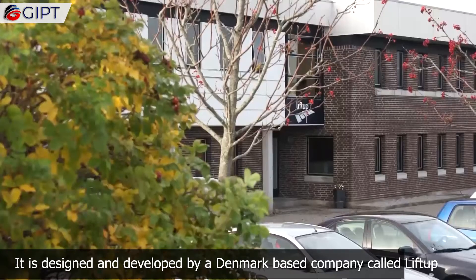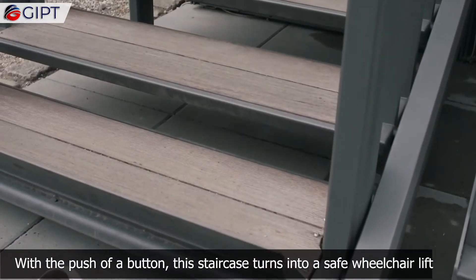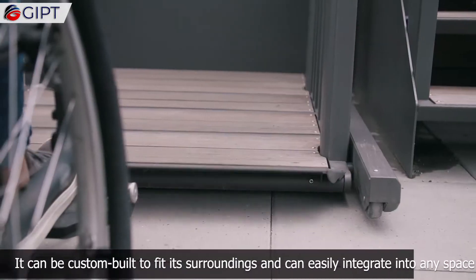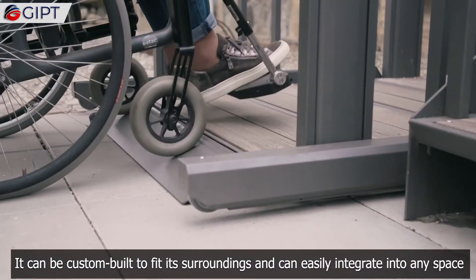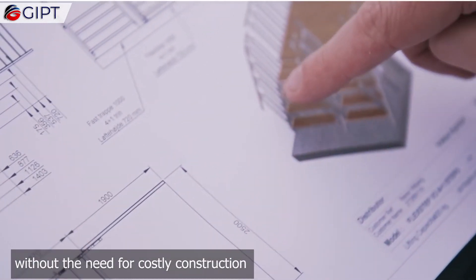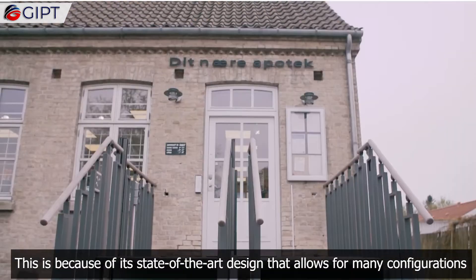It is designed and developed by a Denmark-based company called Lift Up. With the push of a button, this staircase turns into a safe wheelchair lift. It can be custom built to fit its surroundings and can easily integrate into any space without the need for costly construction. This is because of its state-of-the-art design that allows for many configurations.